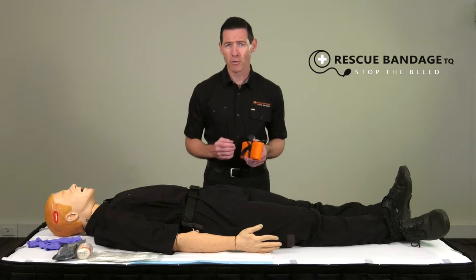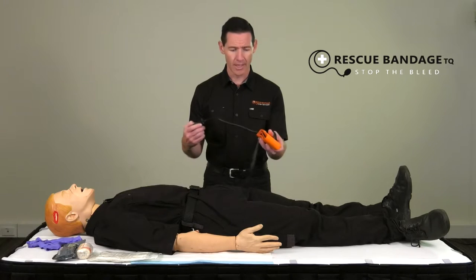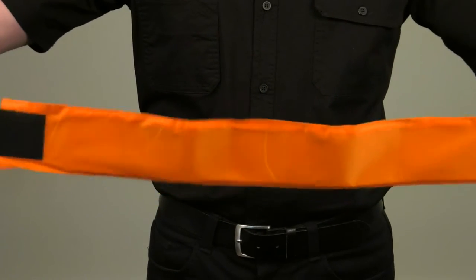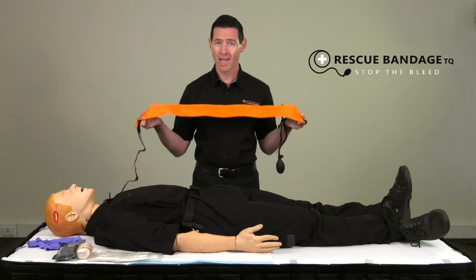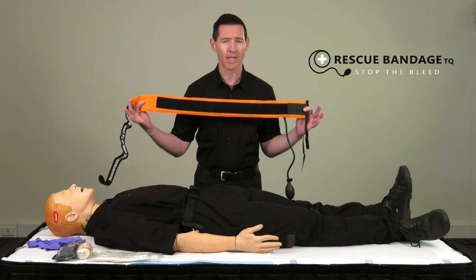Firstly, remove the rescue bandage from its packaging. You'll then need to undo the bandage so that it's ready to apply. Make sure that you extend the bandage all the way. Once you undo the rescue bandage, quickly identify the inside and outside of the bandage to ensure correct application.